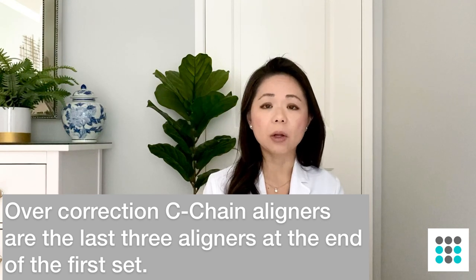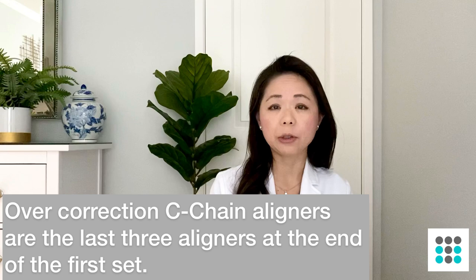The next thing is residual spaces. Sometimes there are small spaces on your teeth that I need to tighten up. I will usually order over-correction aligners called C-chain aligners, which close up the space without needing me to order more aligners — so I always do that for all my cases as a cheat way of reducing the need for refinements. Another reason we might need refinement trays is that the bite is not fully corrected. If you're wearing elastics with your aligners, make sure you wear them 22 hours a day. If your teeth are straight but your bite isn't fully corrected, I would have to order more aligners just so you can wear your elastics to fully correct your bite.